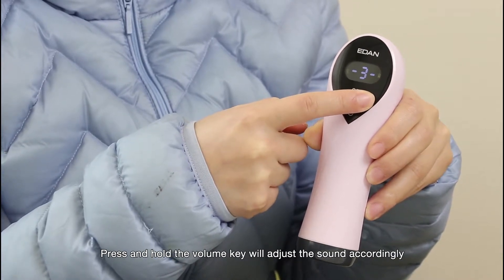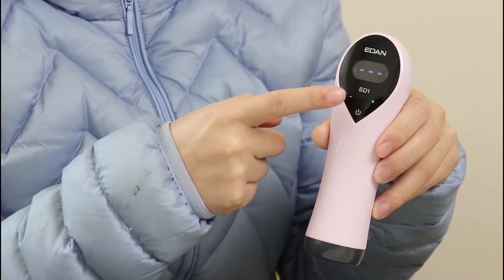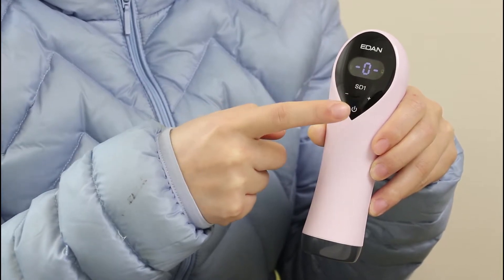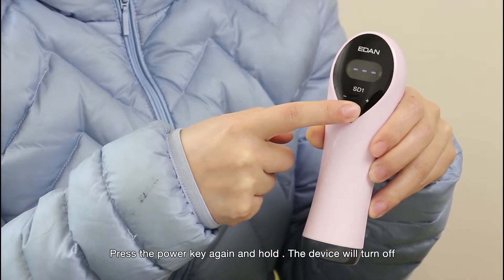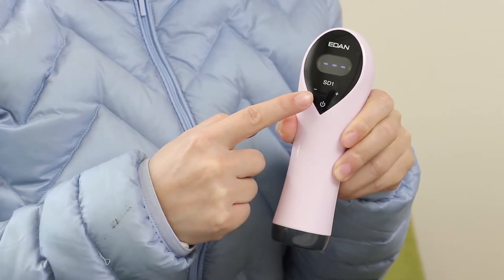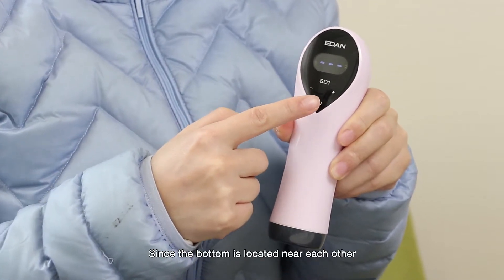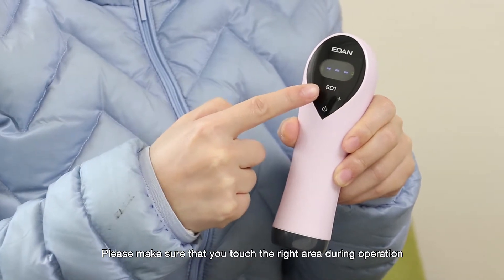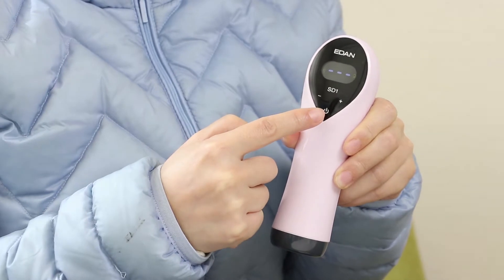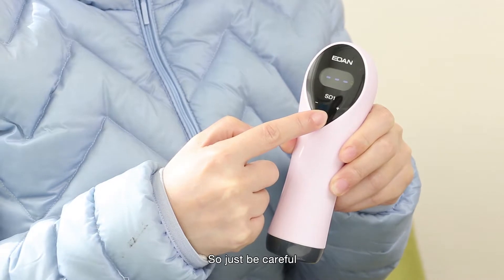Press and hold the volume key to adjust the sound accordingly. Press and hold the power key again and the device will turn off. Since the buttons are located near each other, please make sure that you touch the right area during operation. It is possible to miss-press the panel due to the limited space, so just be careful.